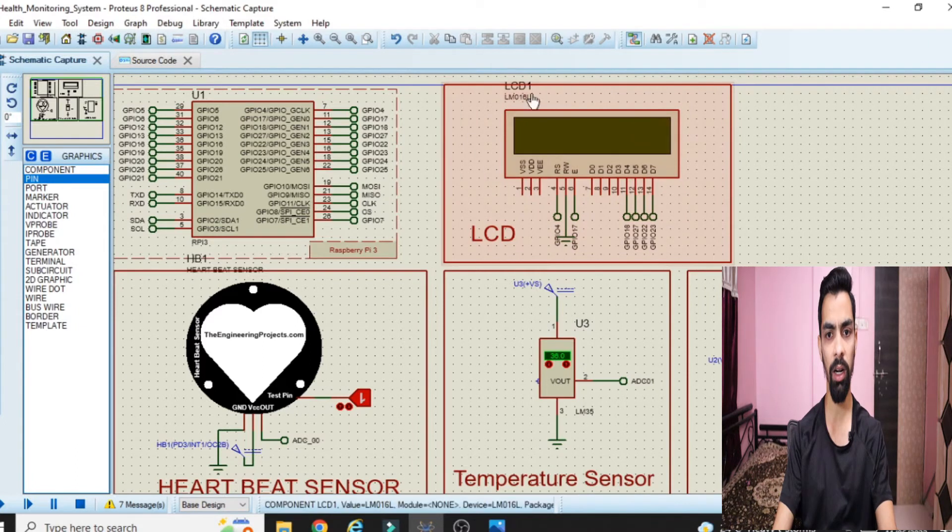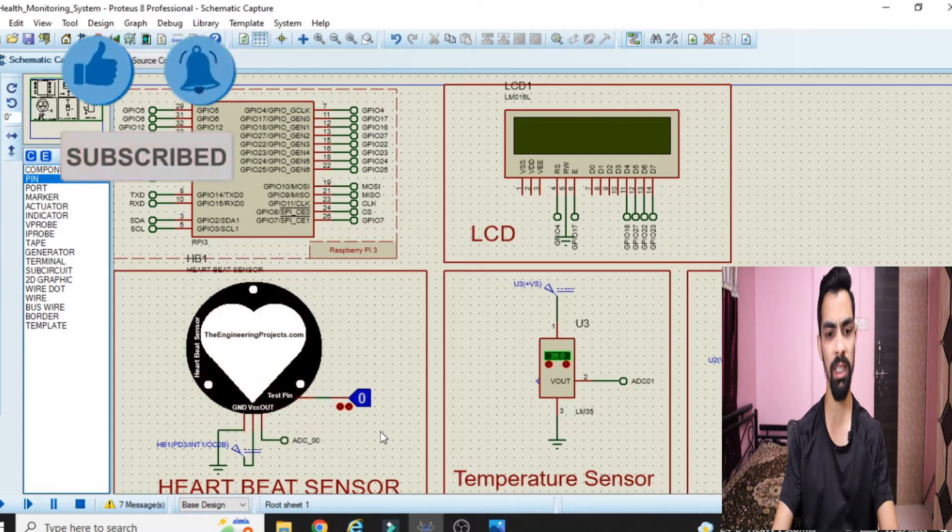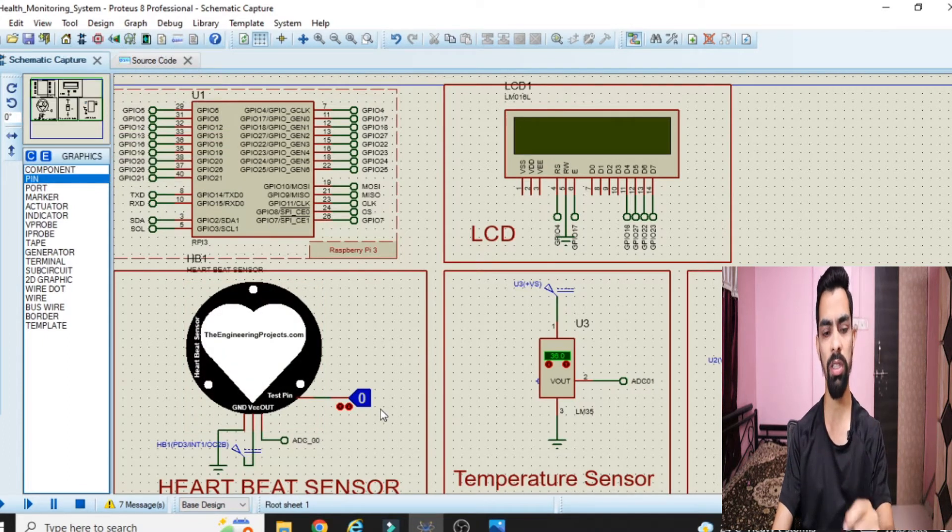The reason pulse detected and not detected appear is because the heartbeat sensor sends a one or zero signal when a heartbeat is detected. Once Raspberry Pi detects a one signal it shows 'pulse detected'; when it detects zero it shows 'pulse not detected'. This repeats for 10 seconds, after which we get the final heart rate. Now I've set the temperature to 35 degrees Celsius.